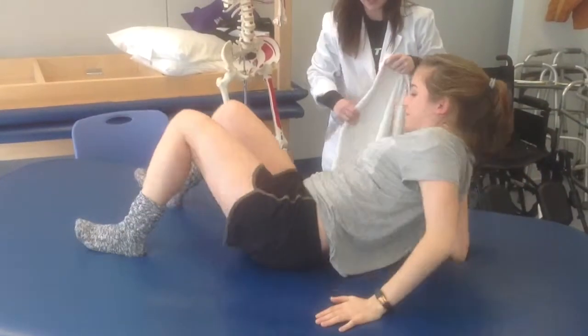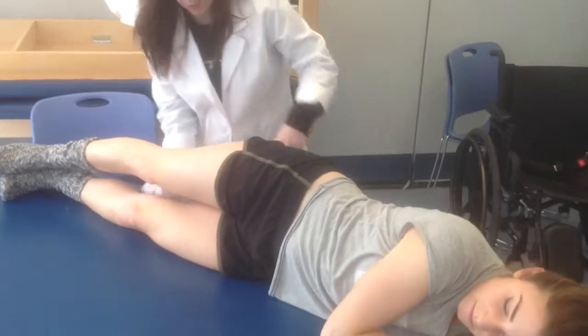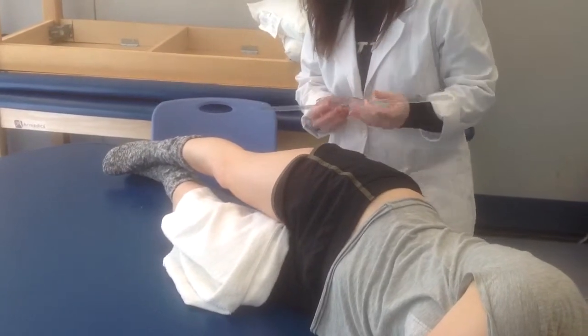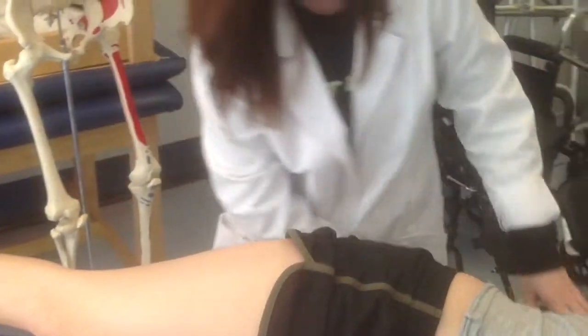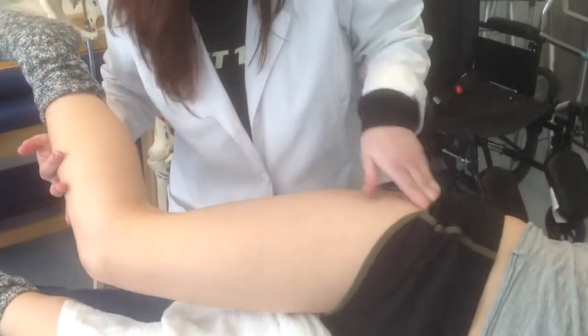Just scoot back towards this side of the table. And I'm just going to drape you one more time. I'll be using the same landmarks for the passive range of motion measurement. So I'm finding her greater trochanter. I'm going to bend her knee and just rotate a little bit to feel for the greater trochanter.